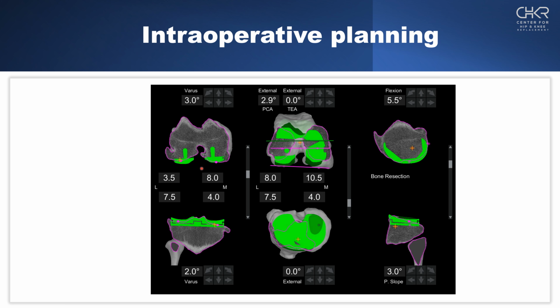So if we look at the femoral component, first we'll take 8mm, okay, because that's what we'll be replacing. We look at the sizing, medial and lateral, and then we can look at maintaining the posterior offset. So here I know the sizing, and I know the depth, and I made sure that I maintain my posterior offset and maintain the radius of curvature.